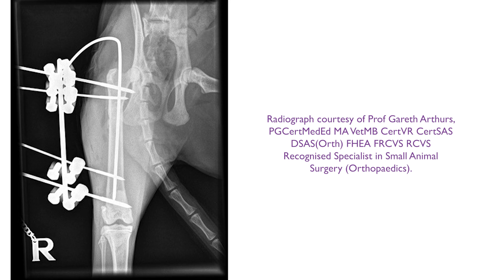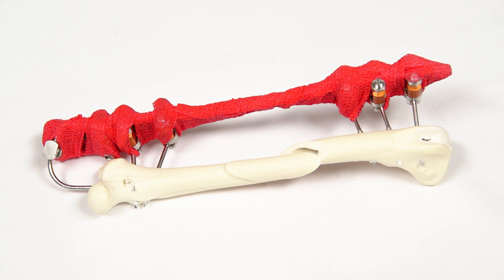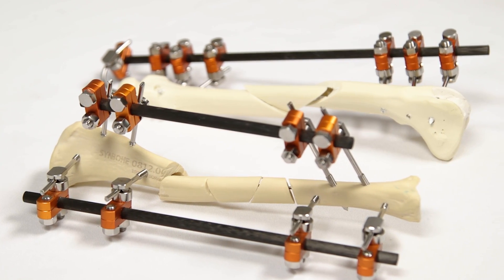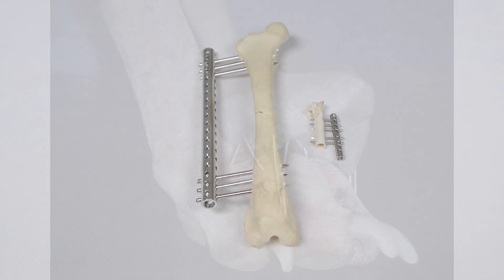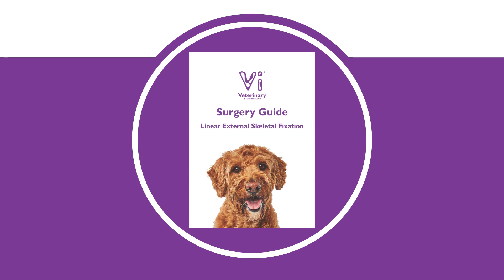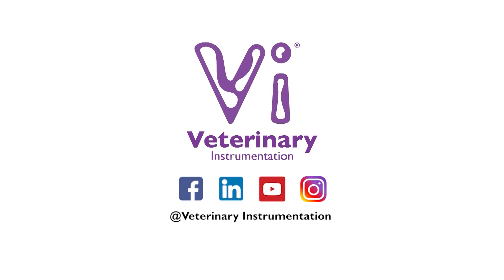Post-op X-rays are taken and the ESF adjusted if necessary. The sharp cut tips of the ESF pins should be covered to prevent damage to the patient, ESF components, and the patient's environment. This video has demonstrated the use of the standard fixator, but VI also supplies other ESF ranges including KE+, FESA, and Epoxy Putty for freeform fixators. For further information on the full VI range of instruments and implants for external skeletal fixation, and to view a comprehensive surgery guide on this procedure, please visit our website or contact our specialist technical support team. Follow our social media pages to keep up to date with the latest releases of training and education material, as well as company updates.